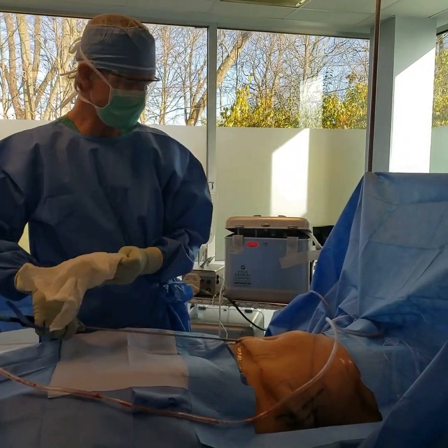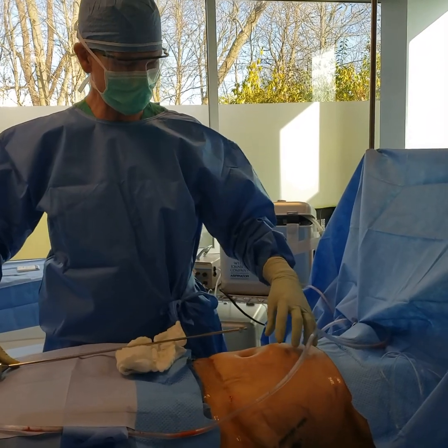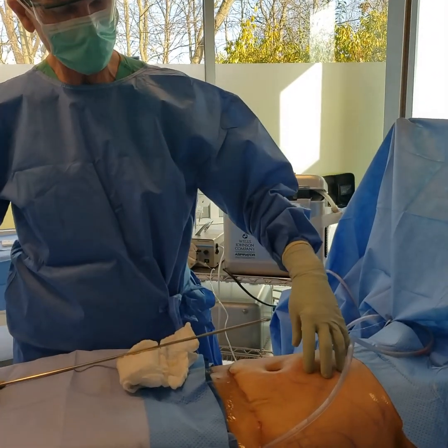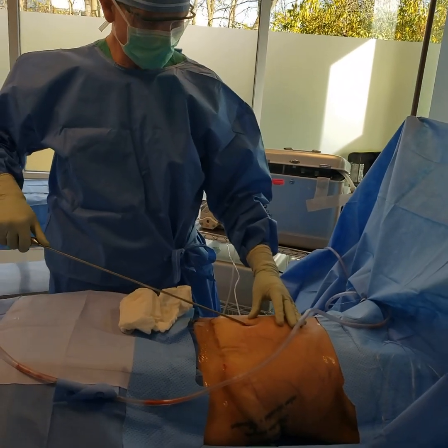So we're redoing this patient's liposuction of her belly. She had a tummy tuck and some lipo, and she was left with this huge bulge up the front of her belly. She has these overhangs on the side. It's a little trickier when you're redoing it because of all the scar tissue.